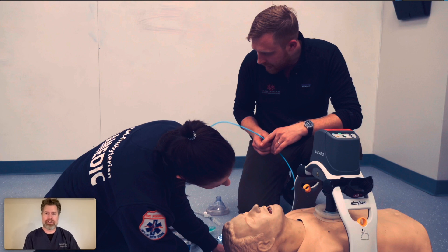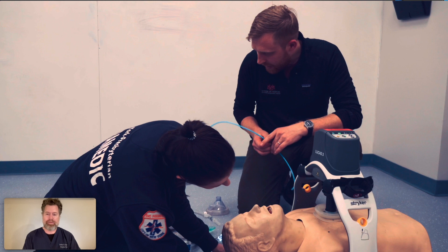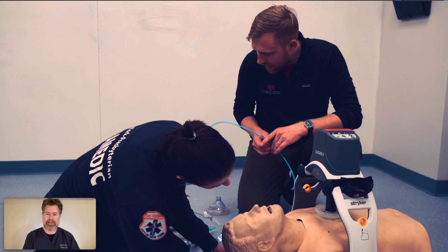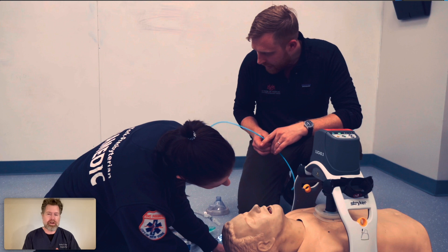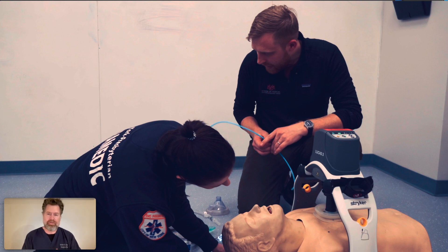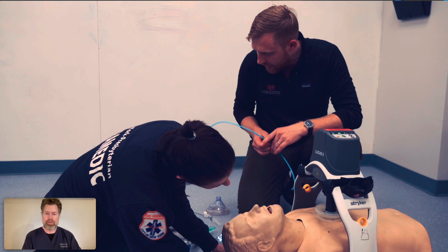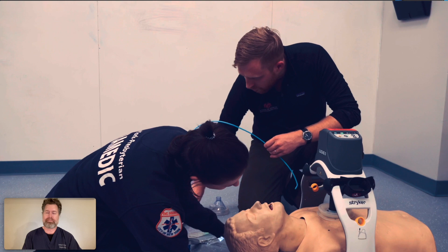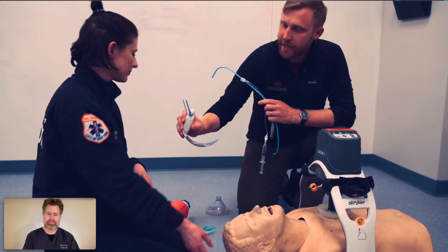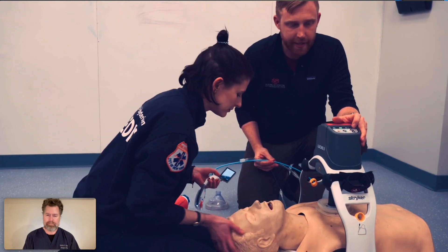Remember that the sniffing position — that ear-to-sternal notch position — is incredibly helpful whether you're using direct laryngoscopy or video laryngoscopy. She's going to use a video laryngoscope, a McGrath blade, with a bougie. We'll hold the bougie and the tracheal tube. Take the video laryngoscope, start chest compressions, and go ahead and intubate the patient.